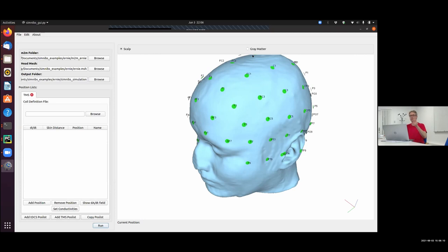There have been attempts to create a rotating field for TMS to get rid of the directionality effects. This has been demonstrated, and that's something you could really simulate by having the separate field components which create the directional fields but are then switched. Basically, you simulate them separately and then add them together later on. So, okay, cool. It seems I hit your question, that's great.